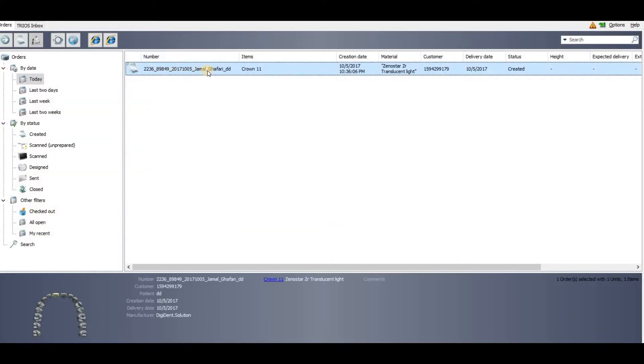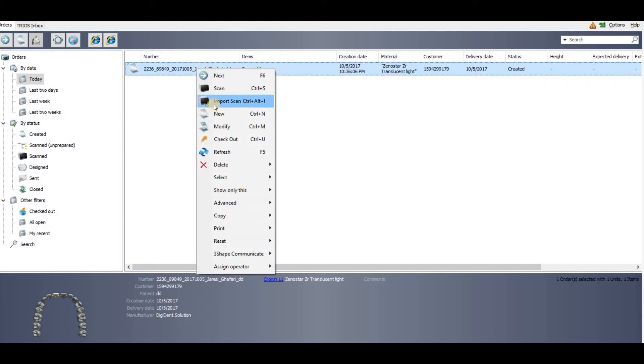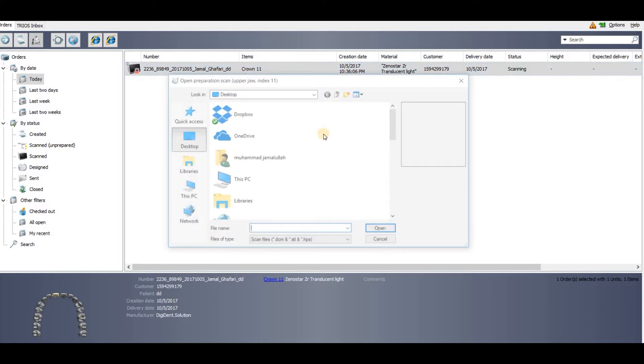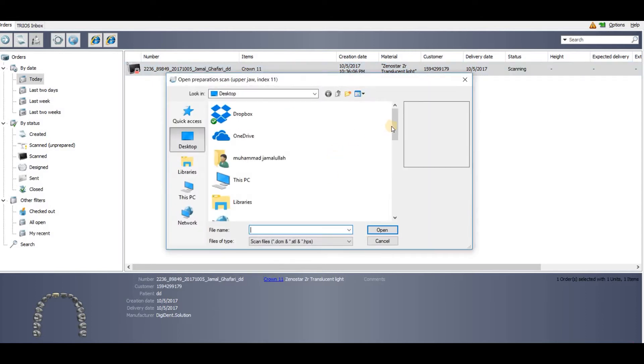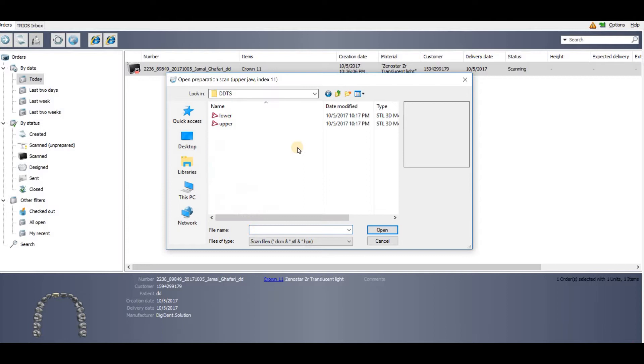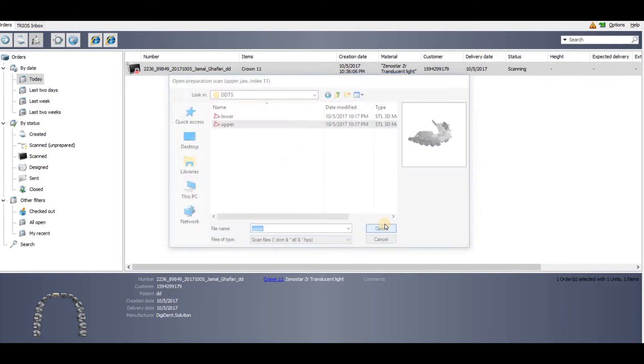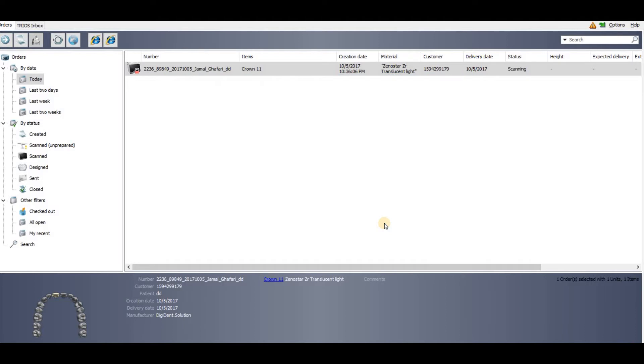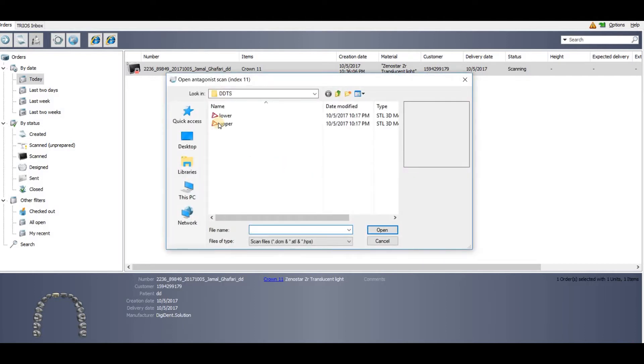Now you have a new order. All you need to do is import the scans where you have put your scan files. First import the upper scan, then you will import the lower scan.